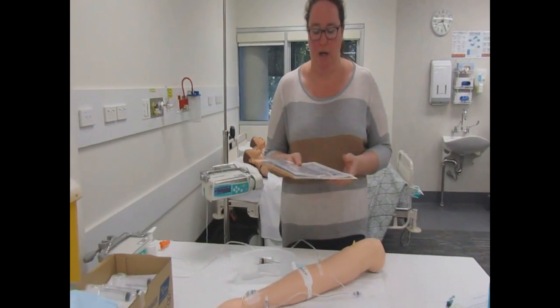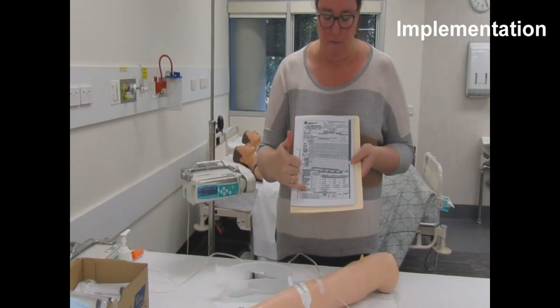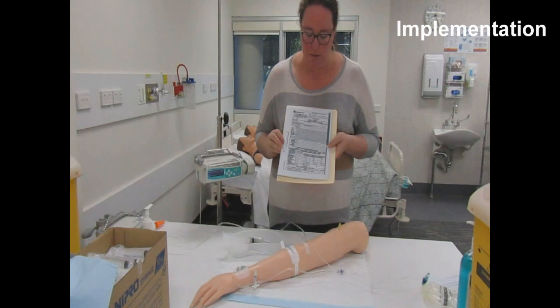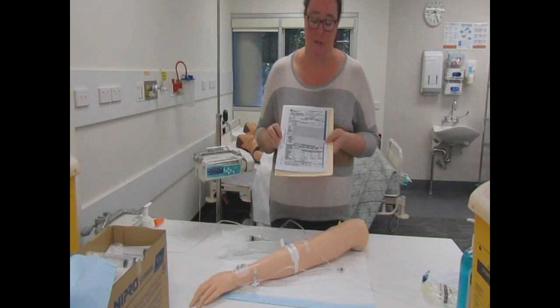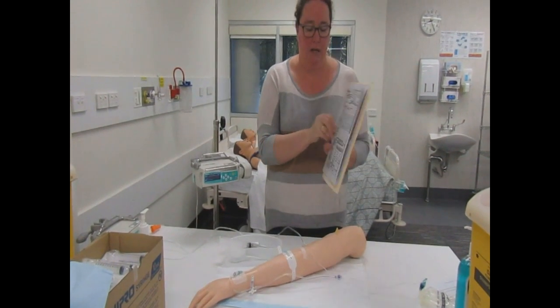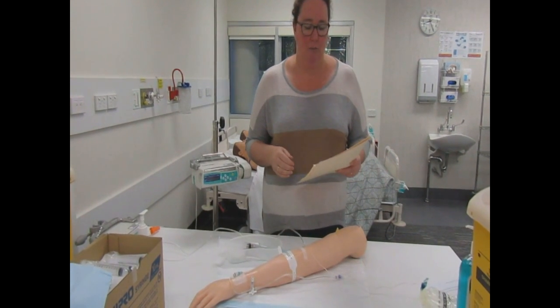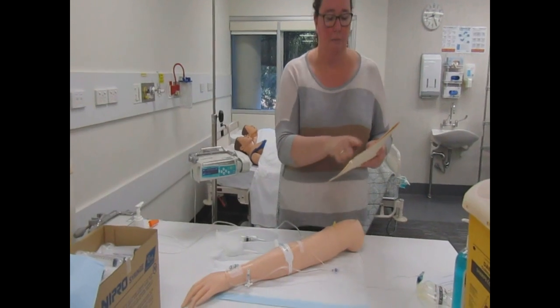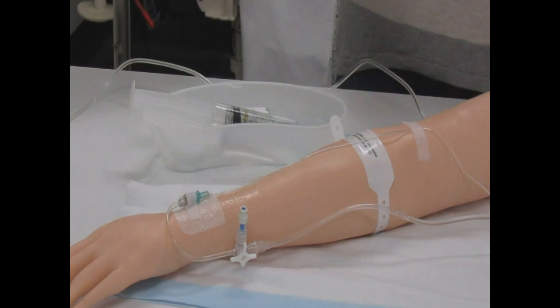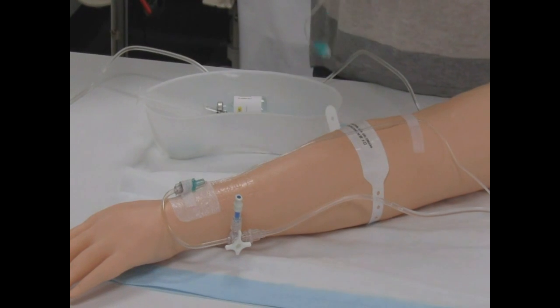Everything has been double-checked by our second RN — or, for students, two RNs. We've drawn this up as per the orders, so we're double-checking now: 50 units of ActRapid insulin plus 49.5mls of sodium chloride — and we'll sign that with our buddy. At the patient's bedside, I'm checking the patient's name and date of birth by asking them to tell me, checking their UR number on their armband against the chart, and whether they have any allergies. I'll also explain the process again and ask if they have any questions.